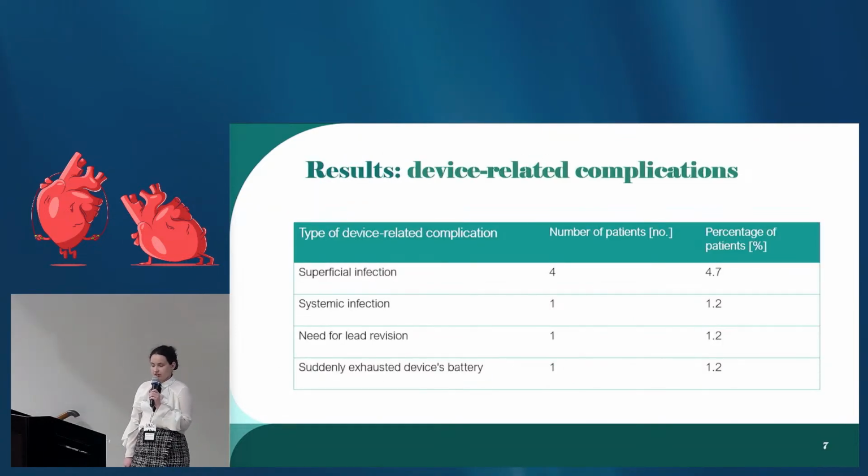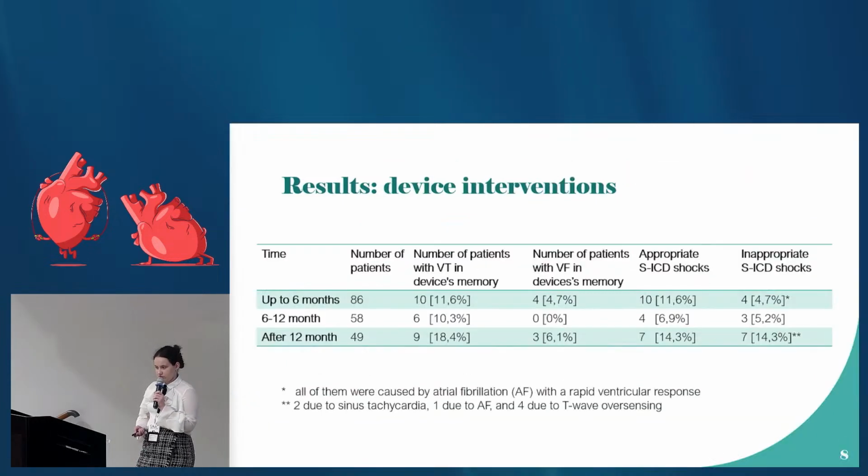7 device-related complications were observed. Superficial wound infection was observed in 4 patients, but systemic infection requiring removal of the SICD device was observed in 1. 1 patient needed lead revision due to the risk of device externalization and lead fracture. In 1 subject, the device battery was suddenly exhausted.